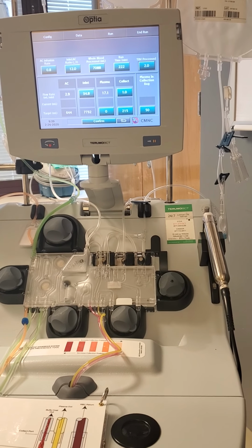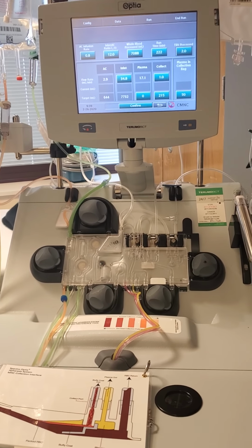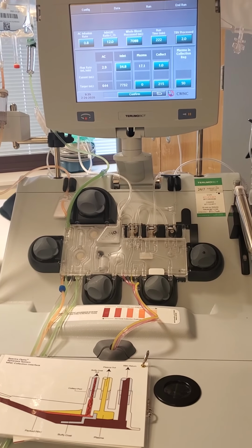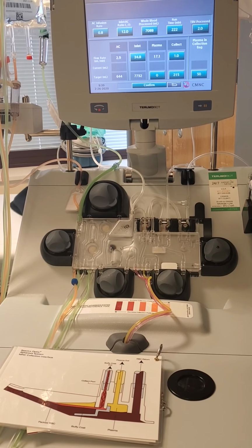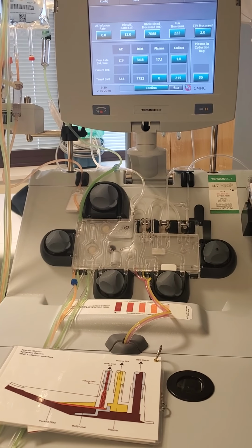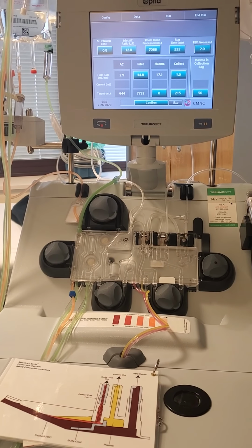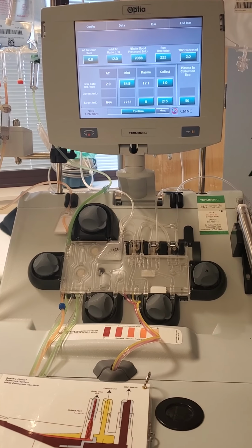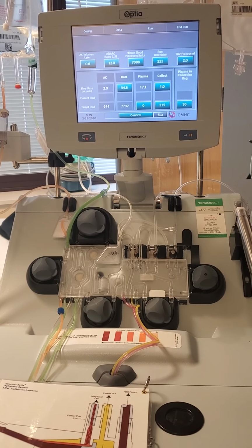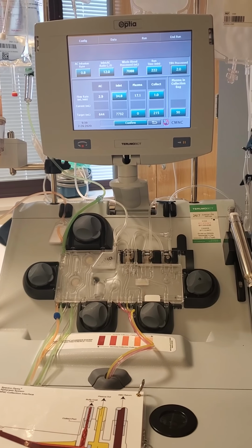Yeah. I want to be able to see that alarm. So an actual, because we don't see our patient on the day of. We see them for screening days before. And what if the hematocrit level is not accurate? A patient's hematocrit, first of all, is not going to change drastically in 3 days. Just guaranteed. Unless they sat at home and had a big GI bleed, right? Or got transfused in the 3 days that you didn't see them. And Opti will deal with a slight discrepancy quite well. So don't make it worse than it is for our newbie here.